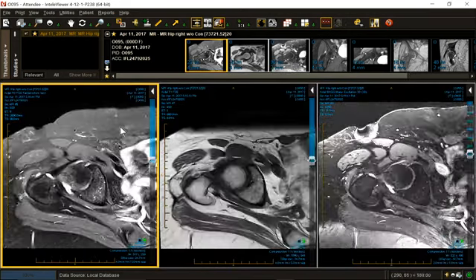Let's look at the coronal. Oh, that's impressive. The patient has stripped away the capsule. This is the iliofemoral ligament. You shouldn't have signal running up between this hypointense area and the acetabulum for more than a few millimeters. So there's capsular stripping, and our cyst has dissected through the capsule. So there's a paralabral cyst that is both intracapsular and extracapsular. There's a spur. There's more joint space narrowing, and early OA. Ligamentum teres, intact. Let's keep looking, shall we?